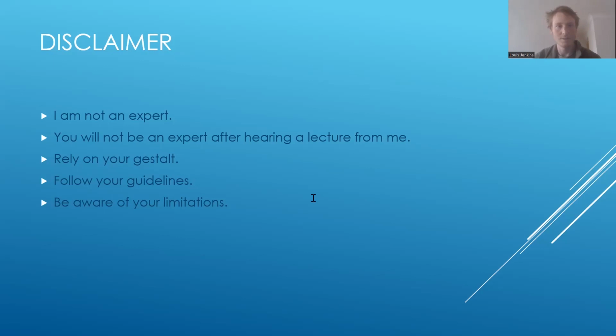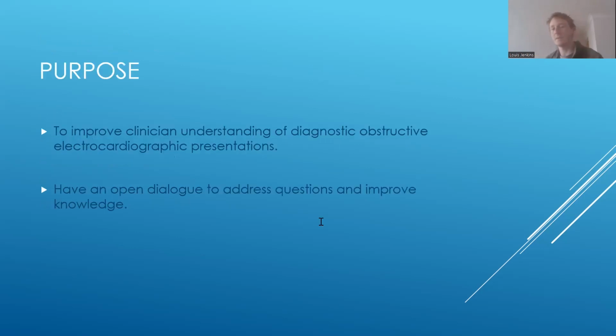Okay. So the purpose of this presentation, it's targeted towards clinicians who do have an interest in ECG interpretation and are hoping to take that knowledge a little bit further. So there's going to be an assumed baseline ability of ECG interpretation going forward from here. Basically, if you're looking to get something out of this presentation, you would be expected to be able to do the basics of interpretation. So to recognize what rhythms are, recognize STEMI, probably targeted towards people with a few years of experience at looking at ECGs. Otherwise, some of these concepts might seem a little bit confusing.